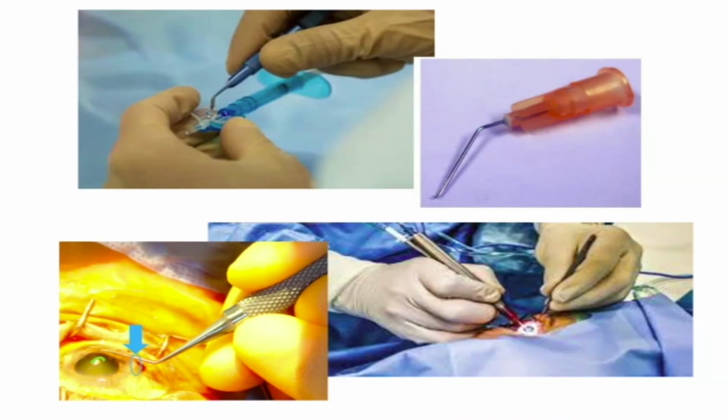Besides whatever was mentioned regarding all the common surgery, in the wet lab the other thing that you can always do is using a microscope and learn how to bend the needle. As simple as bending the needle, sometimes will really make you stand out from others. You already know how to do it. How to do the lens as well.